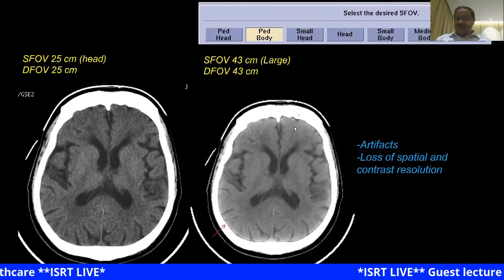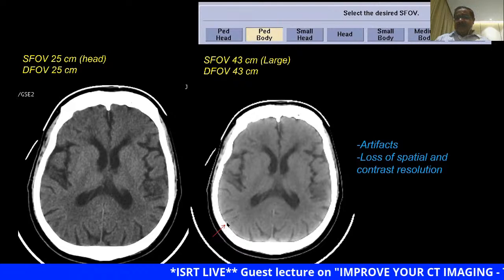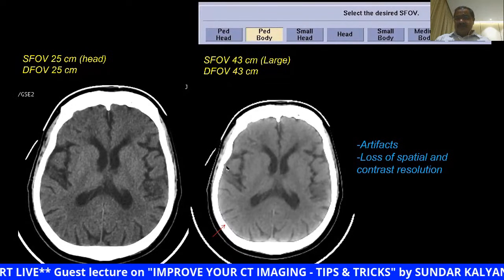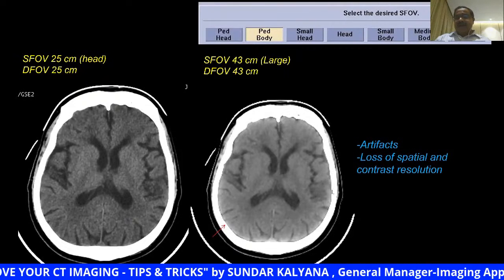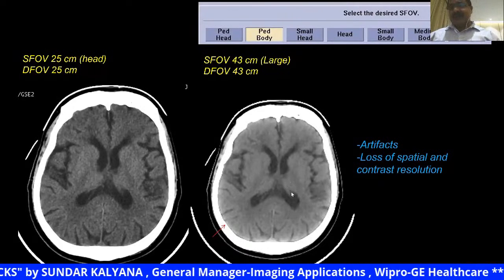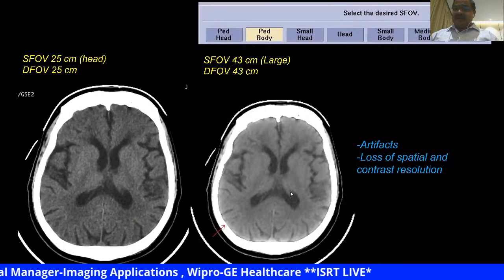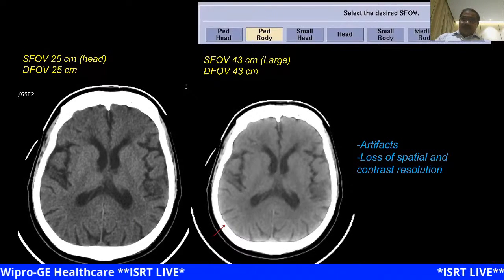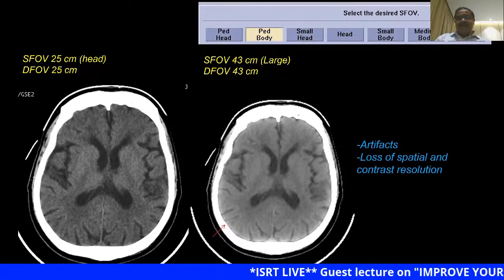You can see that it has a low resolution. Also, where I put the red arrow, you can see an artifact, a black colored line all around the brain-bone barrier. This is because of uncorrected attenuation which has happened there because of beam hardening, which clearly says that use of a large scan field of view is not good for small anatomy, right?